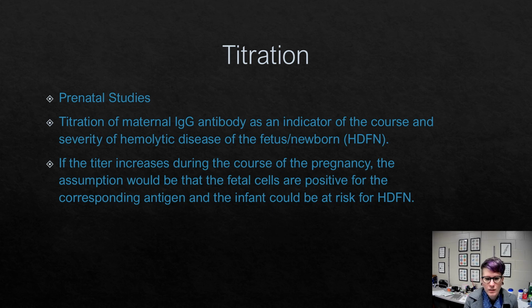For prenatal studies, we will titrate a maternal IgG antibody to make sure that the HDFN isn't progressing. If the titer keeps increasing, then the doctor may want to start using other test methods to actually make sure that the fetus is doing okay.